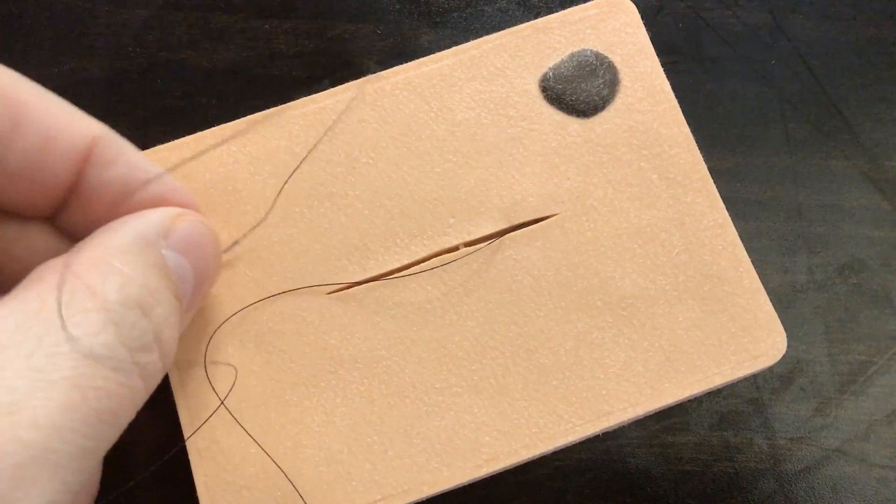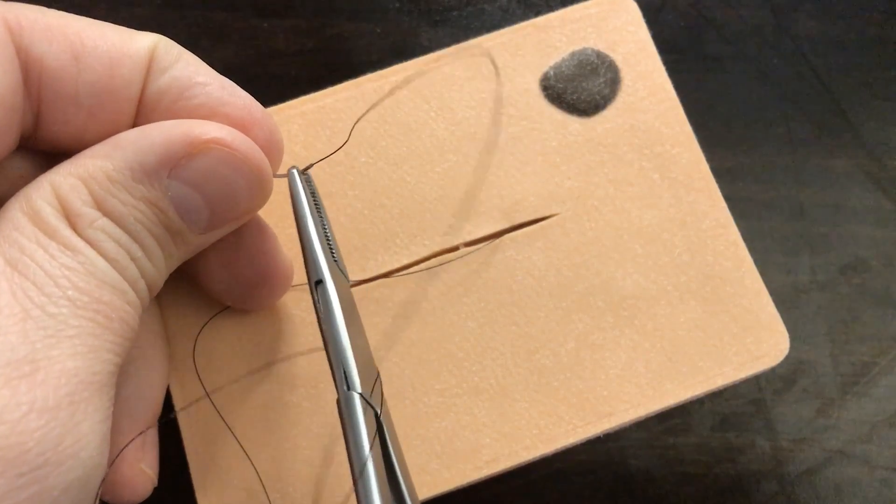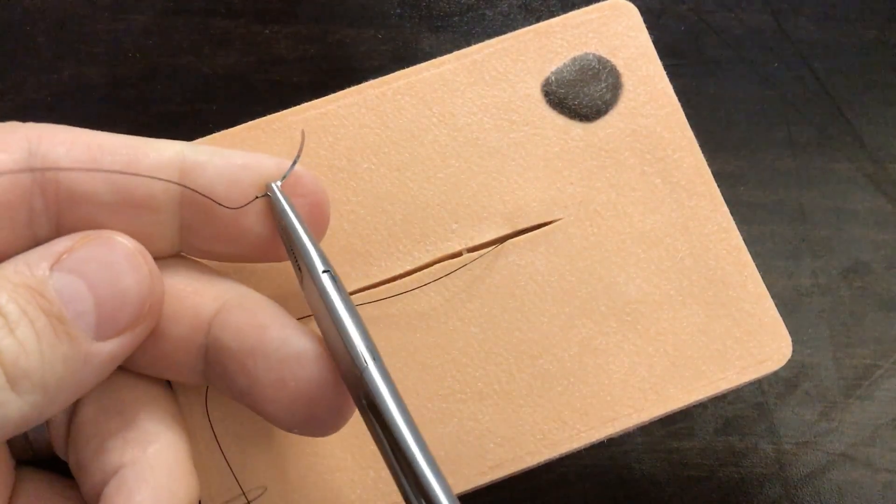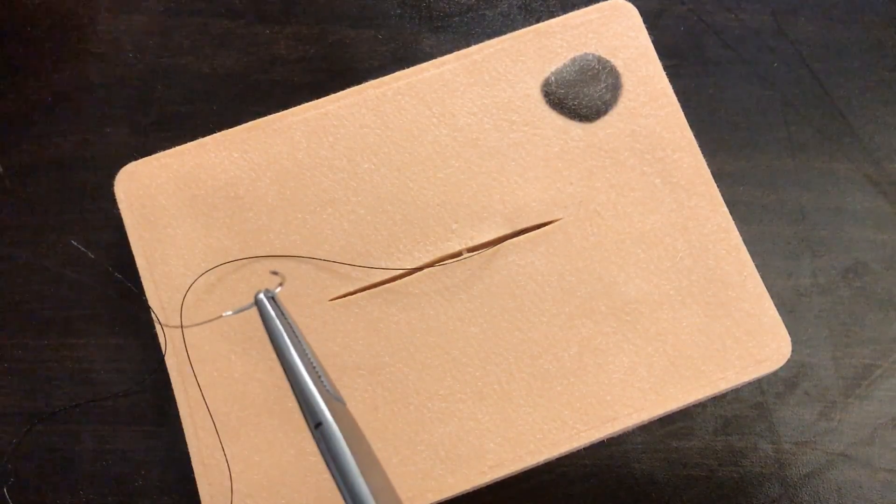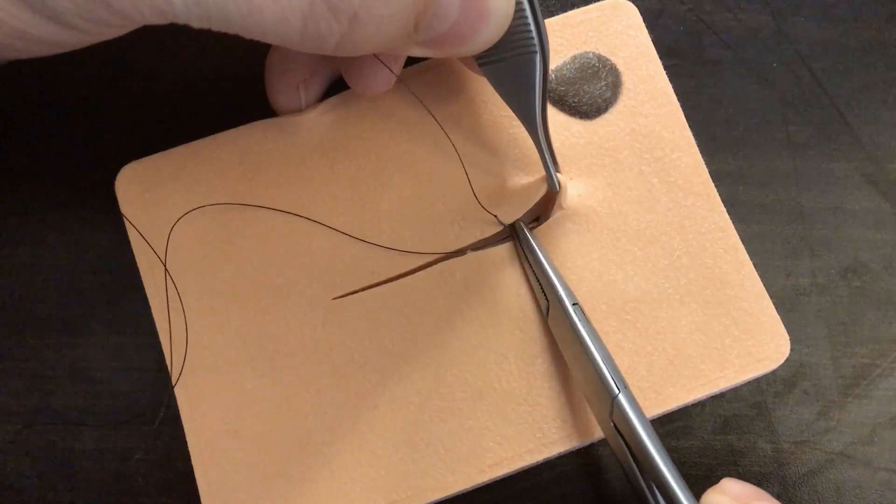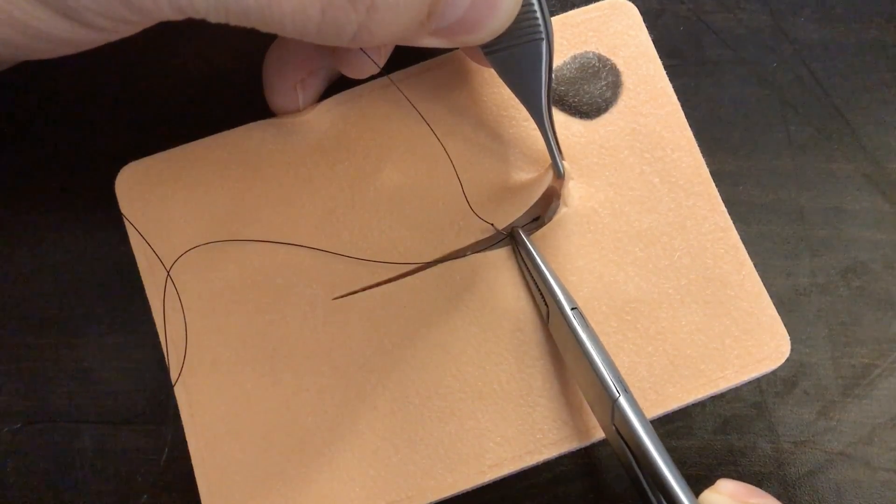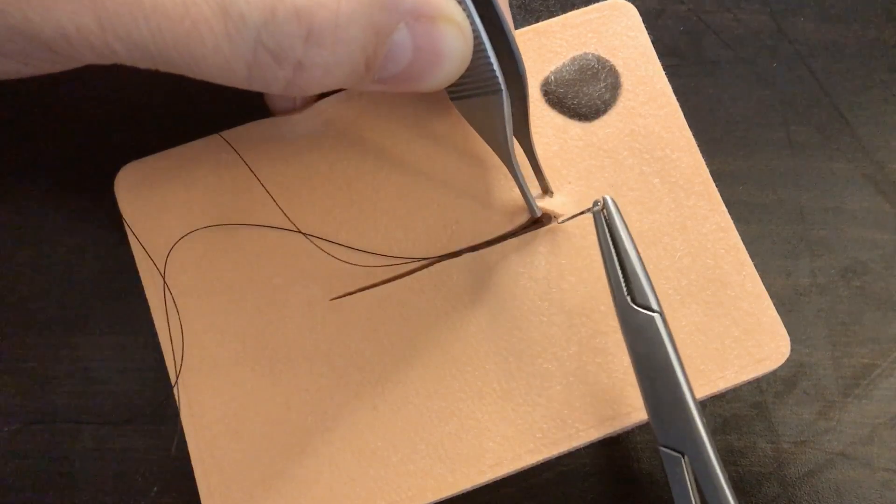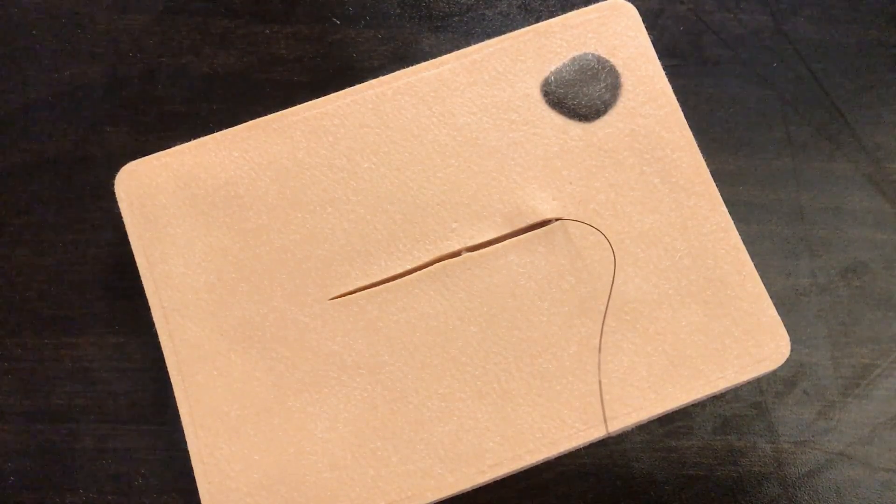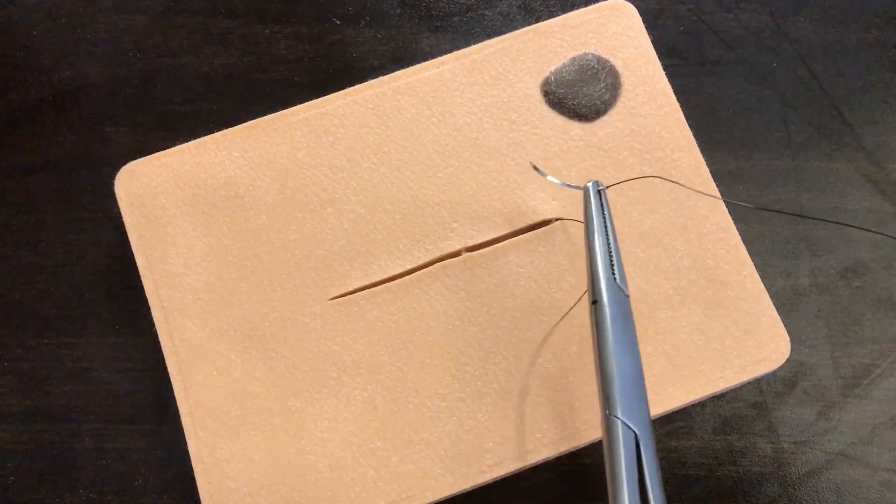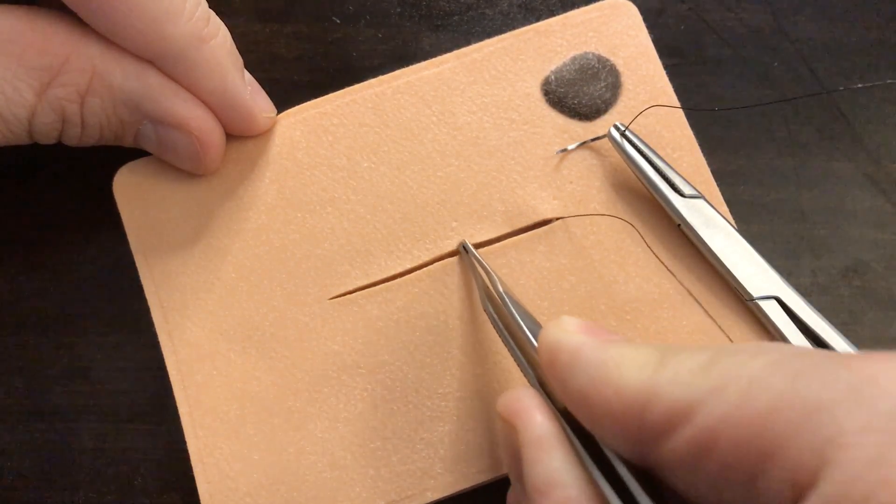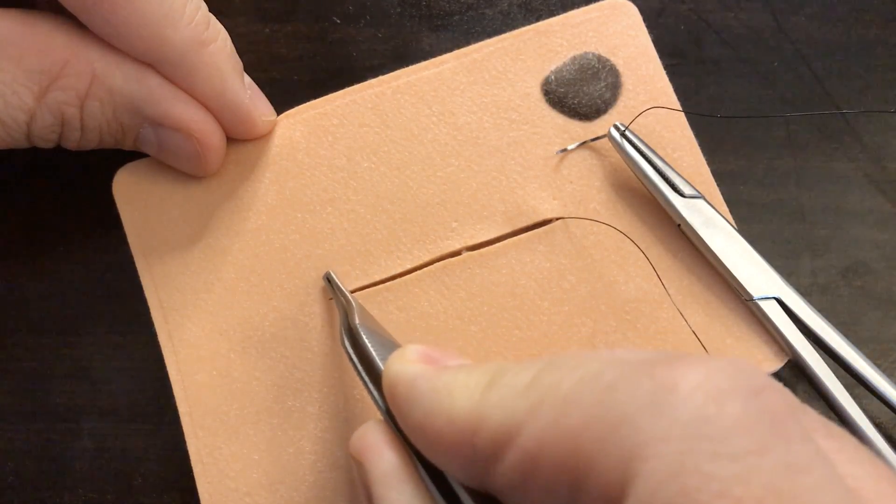So now the next step, I would normally load my needle. I'm kind of breaking one of my own rules here, but I'm touching the needle with my fingers. But I would normally load the needle this way, but for this first step I'm actually going to load it backhanded. And you'll see why here in a second. The next step here is to start in the apex of this, in the subcuticular area, which is very, very superficial. So I'm going to start kind of deep here and notice with the wound, I want to come right into the apex just below that level. So really superficial, not above the skin, but now I'm starting there at the apex of this incision. So now I'm going to load my needle to the front hand direction. And the idea here with a subcuticular suture is that I'm basically drawing an S. I'm going back and forth through the patient's tissue in the same horizontal plane, very superficial, drawing this S-shaped pattern until I get to here.